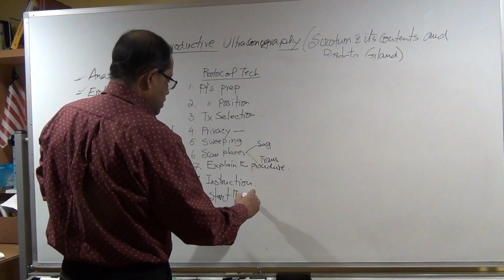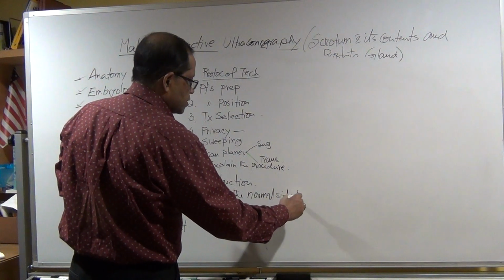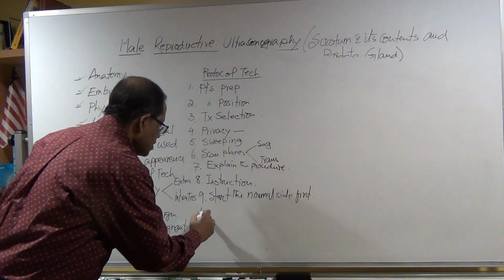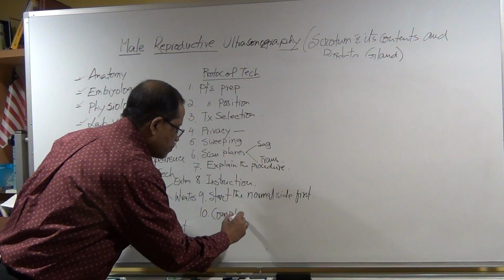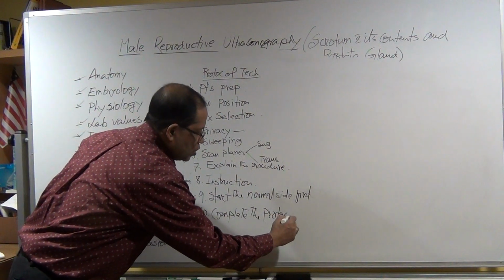Start the normal side first. Complete the protocol.